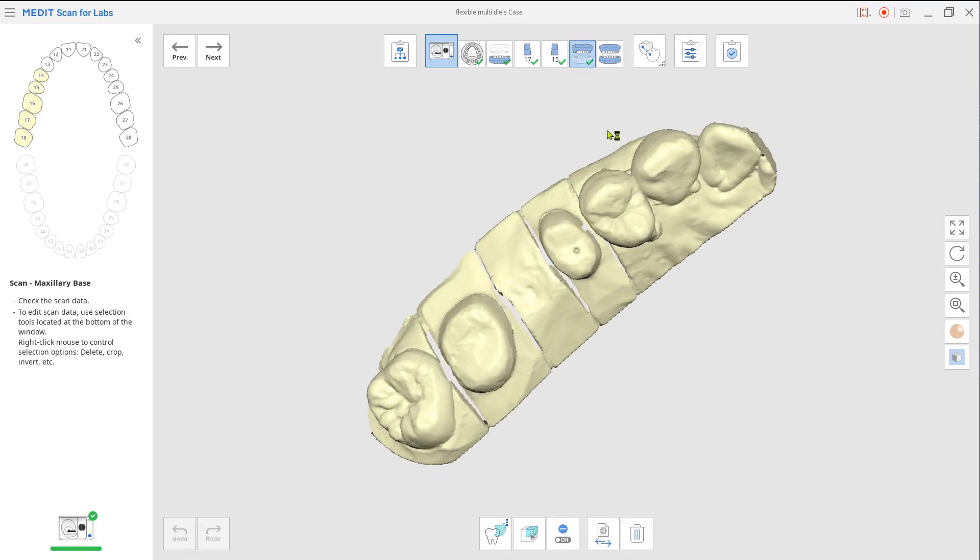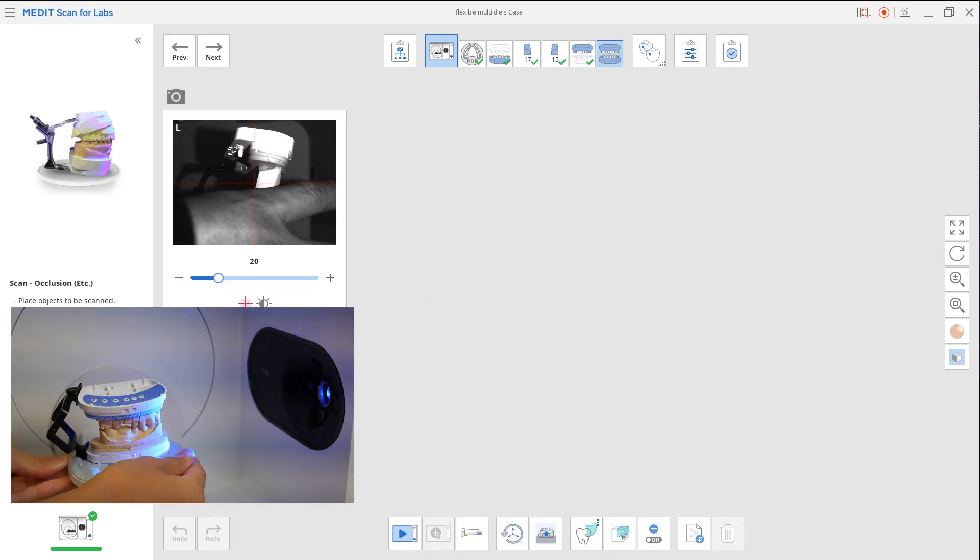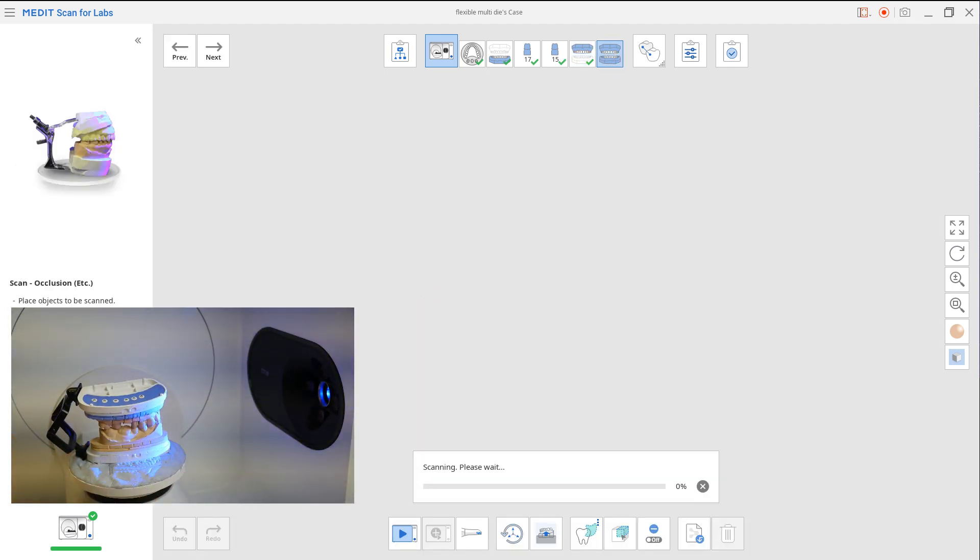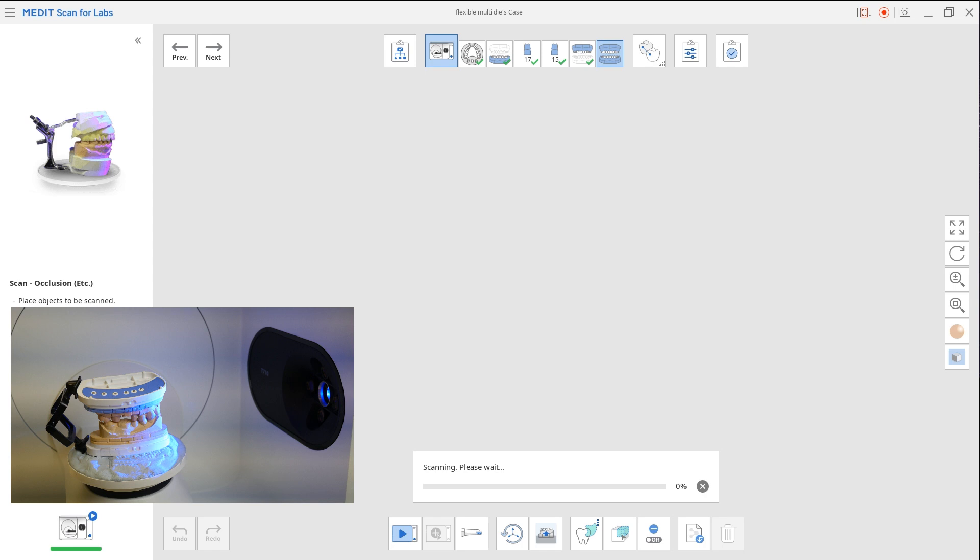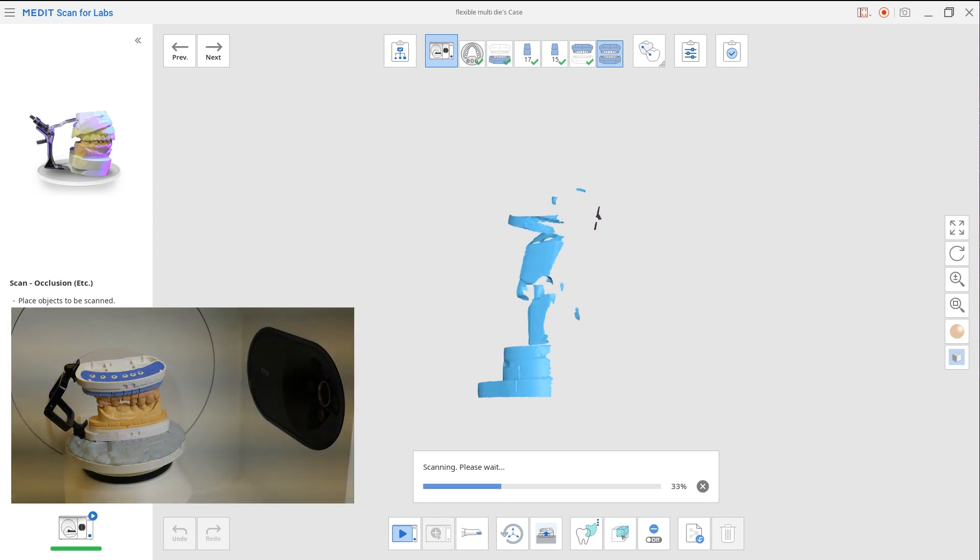Now click the occlusion scan. Have your upper and lower model be in occlusion and place them on the jig, and perform the scan.